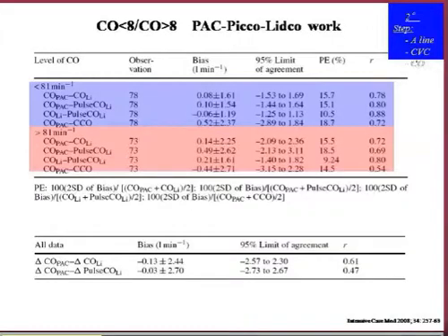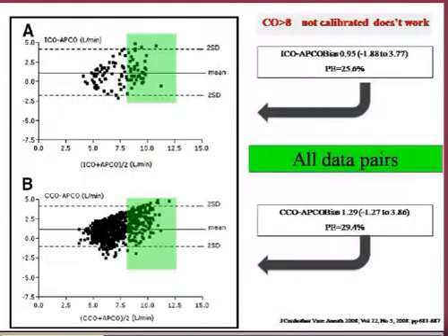To be more precise, remember that when the cardiac output is higher than 8, LiDCO and PiCCO work. When you are in a hyperdynamic condition, remember, not every technique is as accurate as the others. Or, for instance, like a Vigileo or like a LiDCO Rapid or like the PRAM, when the cardiac output is higher than 8, look at the points of this Bland-Altman graph. They go up, of course.